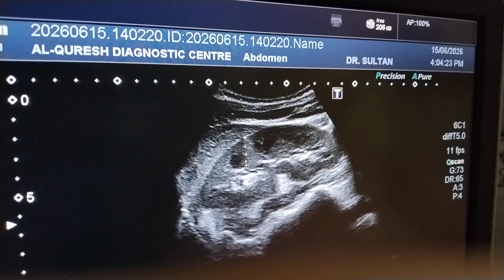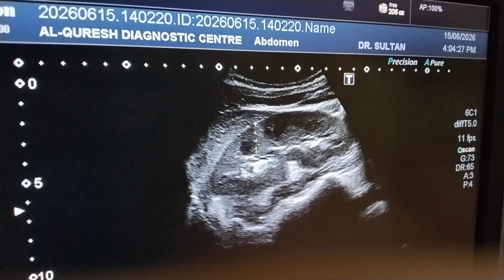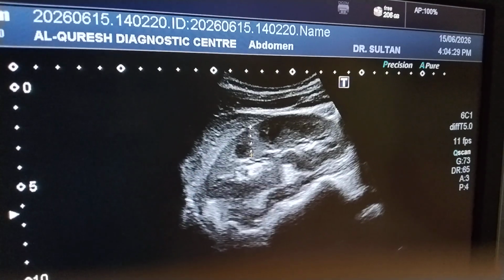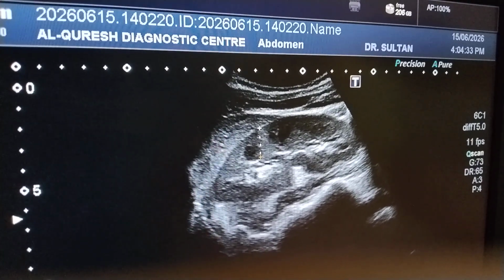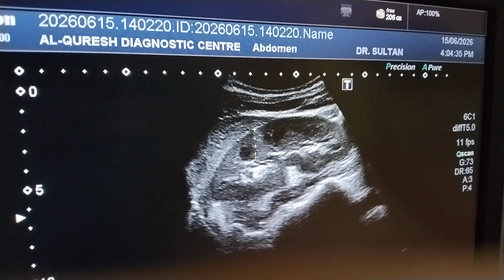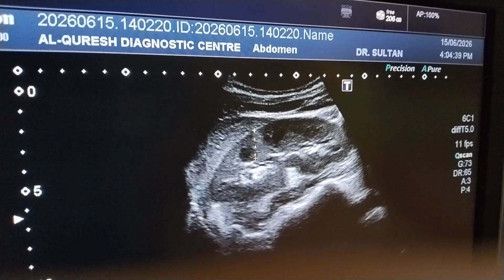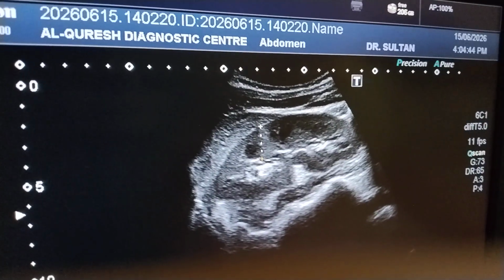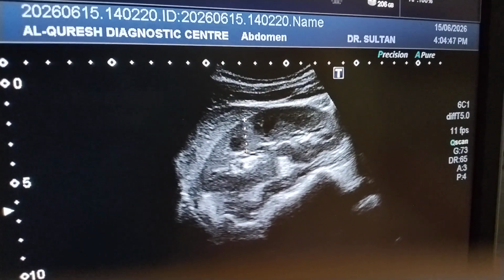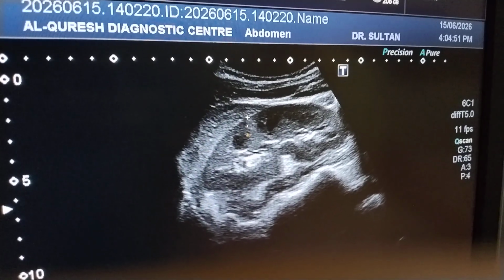So these are two different things, because the urologist sometimes needs the cortical measurement, sometimes the parenchymal measurement. So we should be conscious about this. We should not include the sinus, only up to the sinus. So this is the parenchymal, and if we want to measure the cortex, this is the cortical measurement.